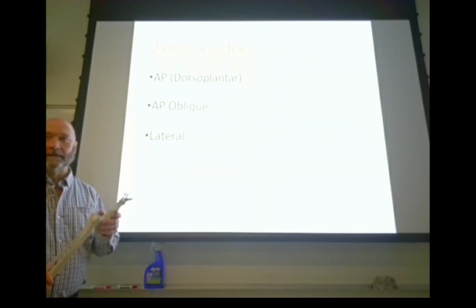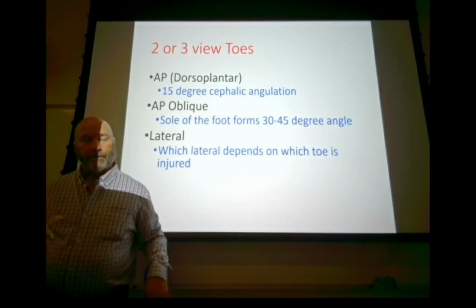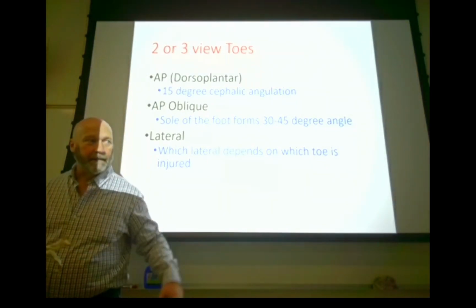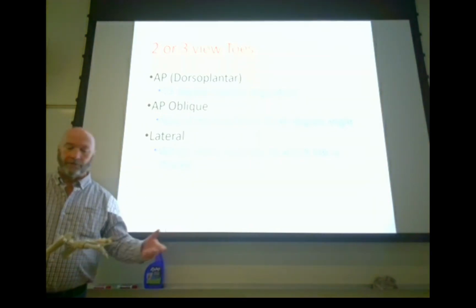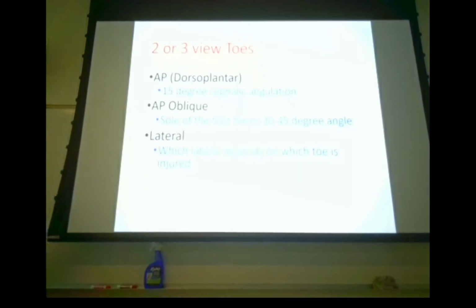But it's kind of hard to get the patient into that position. What you're going to have to do is have the patient up on their side and their knee in contact with the tabletop to get them into that position. May be very uncomfortable for the patient. But remember that for the test, all the way through the registry, medial side down, more consistent, good lateral position.